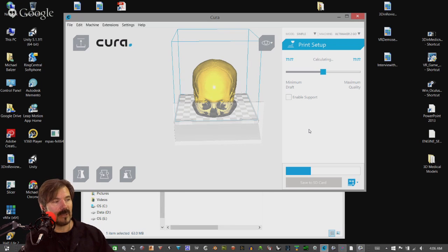That's the sad thing about 3D printing right now, it still takes a while. But what was your recourse before this? I think, Javin, you're wanting to try a low-cost solution. Yeah. There are locations like Shapeways, but I'm also assuming you want to go this route because of HIPAA and privacy concerns, so that way you don't have to provide any information. You can do it all in-house.